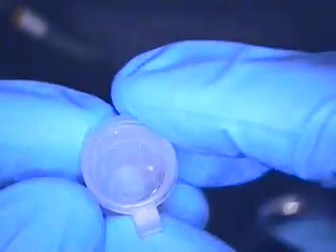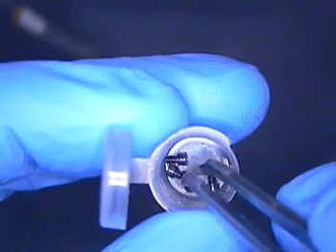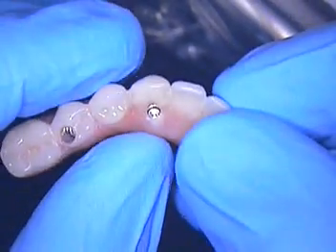Alright, so now what we'll do is grab a pair of cotton pliers, and we're going to slowly add our screws. And I've collectively placed them all in a little vial. Very, very small, dainty little screws. I'll just put one at a time, and slide that in. Take the next screw. That one's in. Number 3 and number 4 are next.